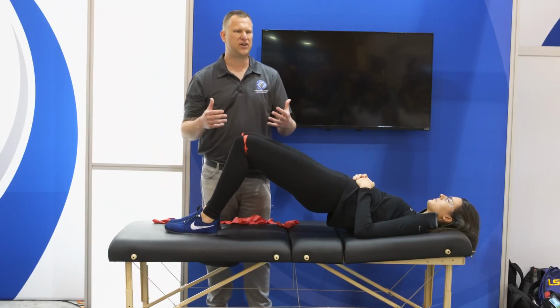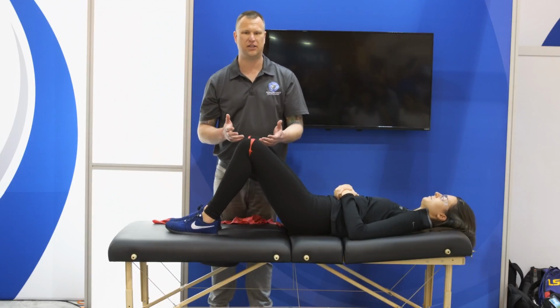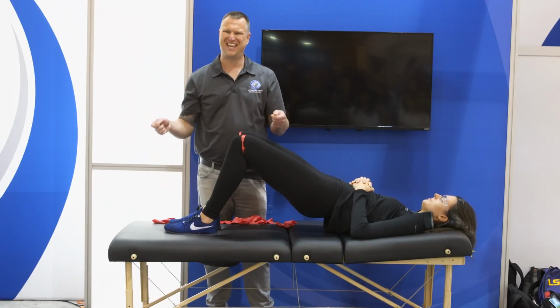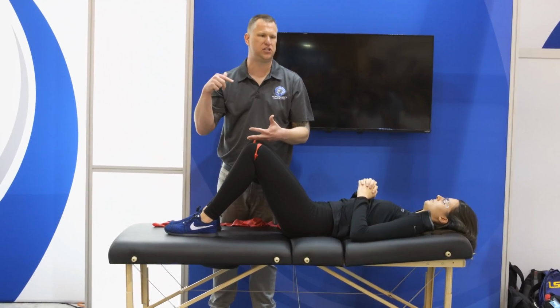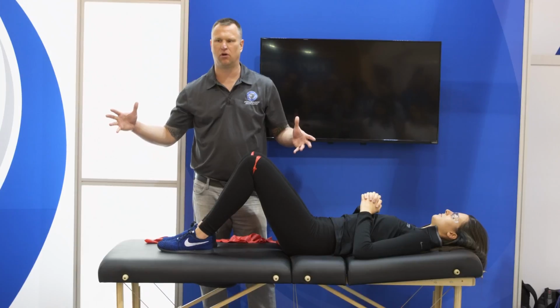Now, some of us are thinking, okay, I can just tie a loop around the knee. That's true, easy done in the clinic, but our patients get home sometimes, they tie it in a loop, then they untie it for something else, and they can't quite remember how tight to put it back to. So that loop size changes a lot of times at home because our patients aren't thinking like clinicians. With the CLX, we can just simply instruct them, we want to do a loop by loop side position, and then maybe we want to use a different variation for something more progressive.